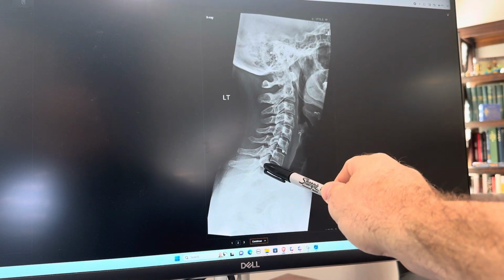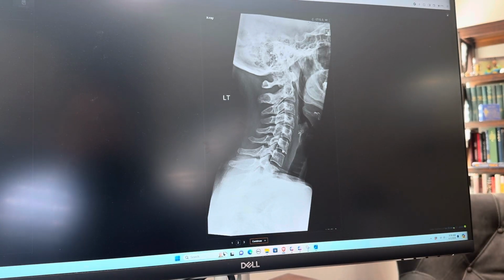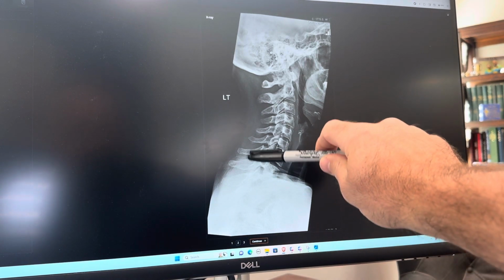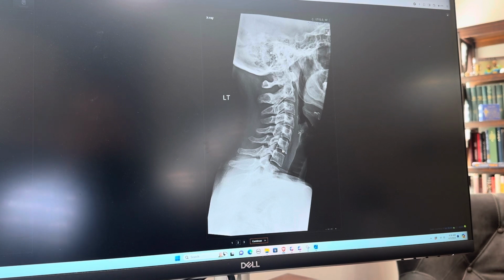What I am looking for is somewhere between 20 and 35 degrees. There's a big variance in that, but people vary in height, weight, distribution, etc. It's when we start getting underneath that 20-degree angle and we start going down towards the negative angulation, which would be curving in the opposite direction, that we start to have some significant neurological problems for patients, right?